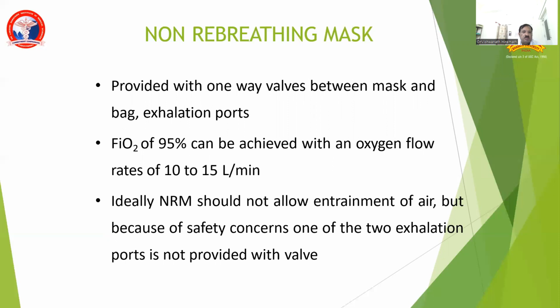Then the next approach will be non-rebreathing mask. Non-rebreathing masks are provided with a one-way valve between the mask and a bag, and through exhalation ports. FiO2 of 95% can be achieved with oxygen flow rates of 10 to 15 liters per minute.